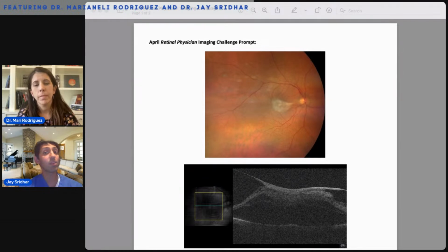So one of the first things as the clinician is distinguishing, is that the cause for their visual complaint? That really boils down to how much of it is about distortion, how much is about curving of straight lines. And then in the exam, looking for anything else that could affect the vision, right? Do they have surface disease or a cataract or anything else that can impact it? If you've ruled out all those things, and you have that match between the OCT appearance, what they're saying, and the exam, and there's no other cause, then I think it's reasonable to talk about surgery.